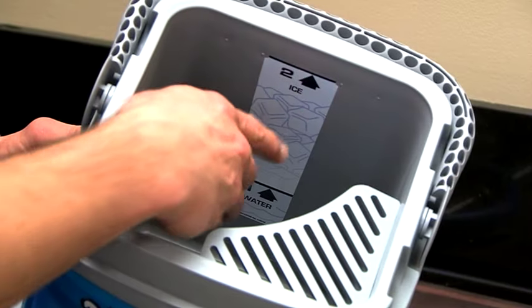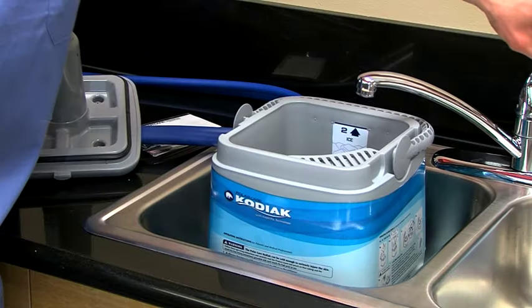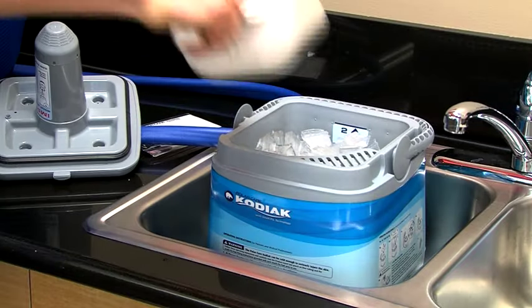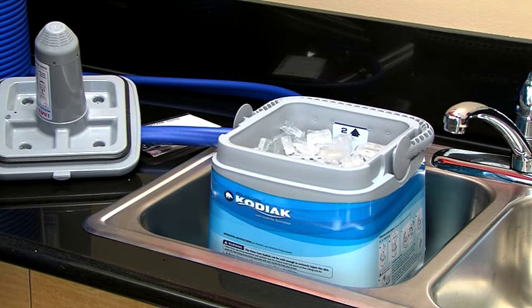Next, fill the unit with cold water, then ice – not the other way around – to ensure you maximize the ice time. Generally speaking, larger ice means longer ice time. Using the ice shown here, the water in the Kodiak will stay under 55 degrees Fahrenheit for 6 to 8 hours.